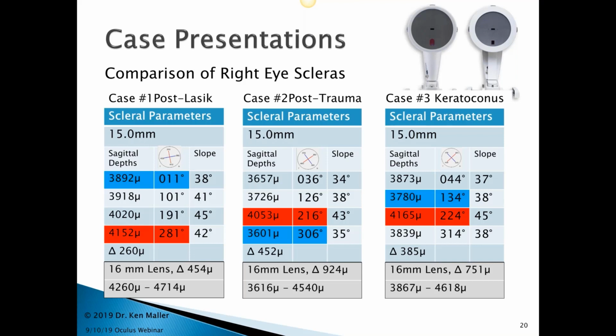As far as the integration with how do we take all that data and then put it into a lens, I can't really speak for the other platforms. And again, for the Pentacam, I've really been using this extensively with Wave, and it's been absolutely fantastic for that particular combination of technologies.